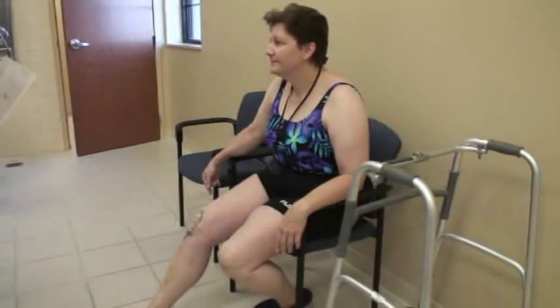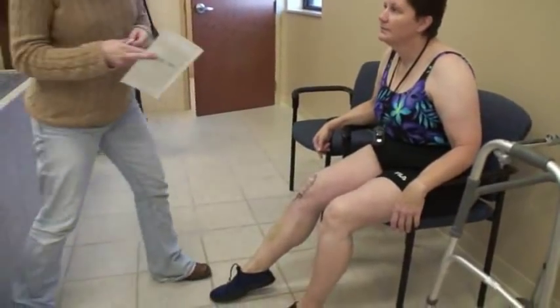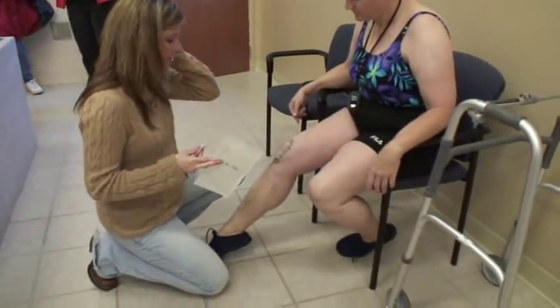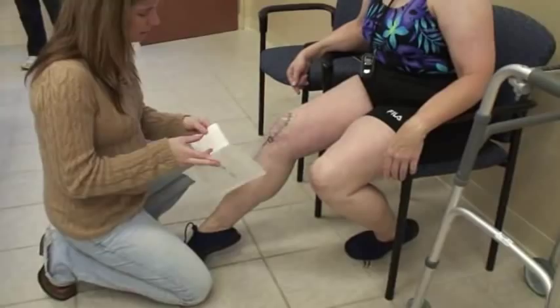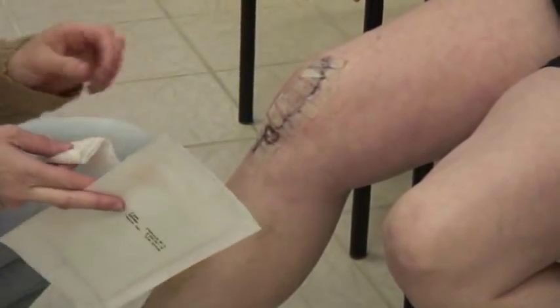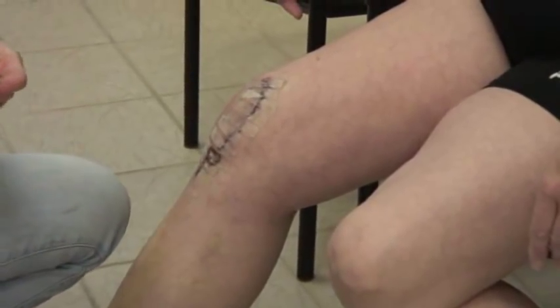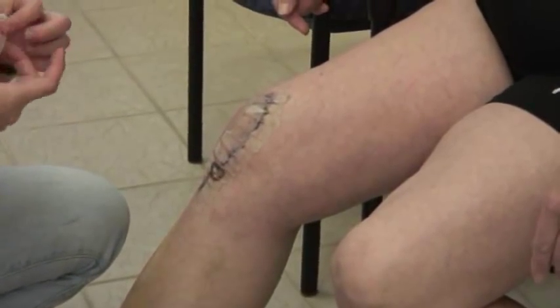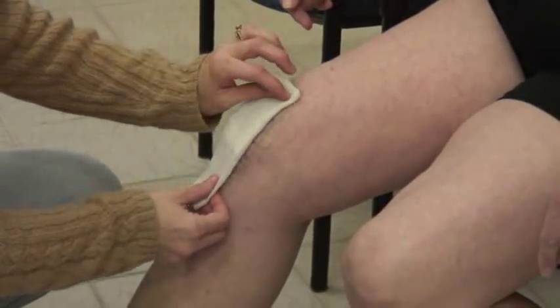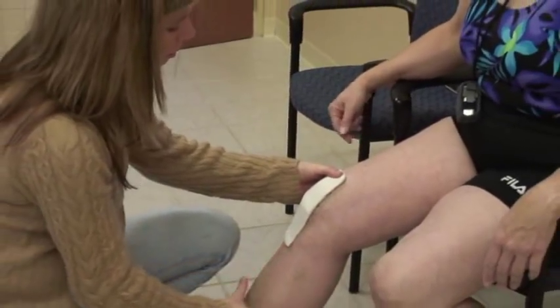We're going to put a bio-occlusive dressing since Lana still has her Steri-Strips, and those usually stay on about two to three weeks before they fall off on their own. Our surgeons don't use staples very often. I put a 4x4 on first so that when I peel off the op-site I don't peel off all of her Steri-Strips.